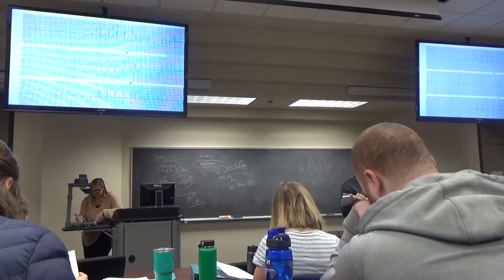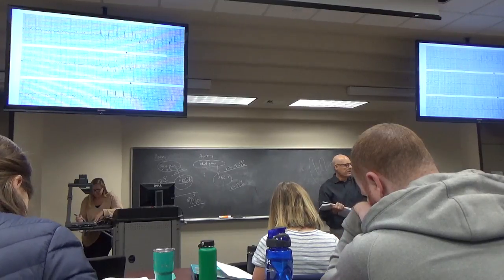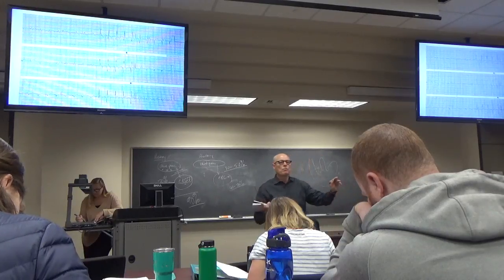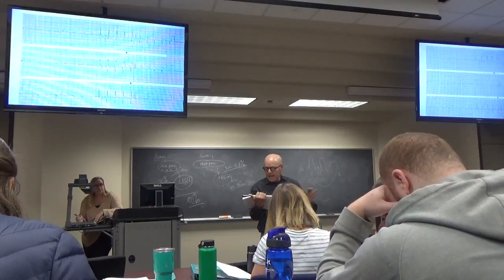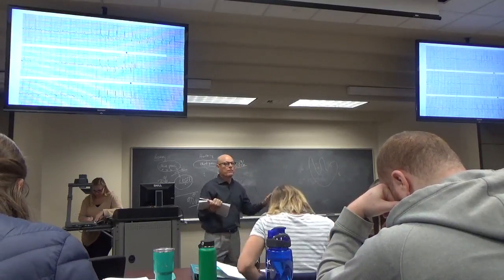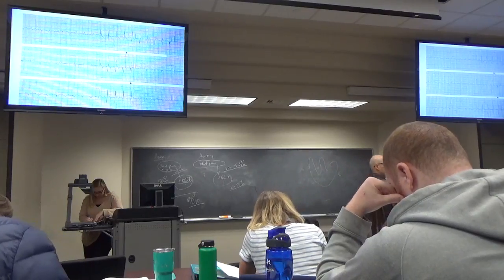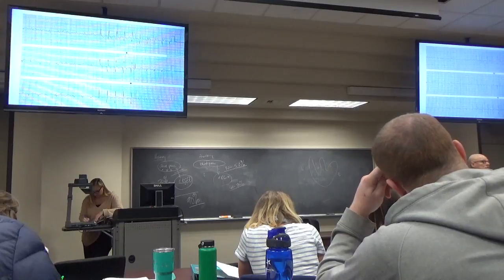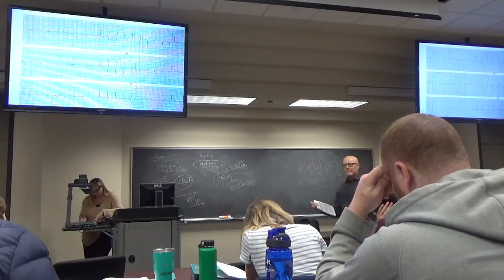That's okay, that's okay. So again, if you've got an infarct V1 through V4, and V5 is sitting right next door, it's in the ischemic zone, so don't worry about that. Let's back up and talk. This is an anterolateral infarct. If you want to throw septum in there, it's fine. I don't say that when I read the EKG. I just say anterolateral because if it's anterolateral, the septum's involved. So it's understood, so it doesn't matter.